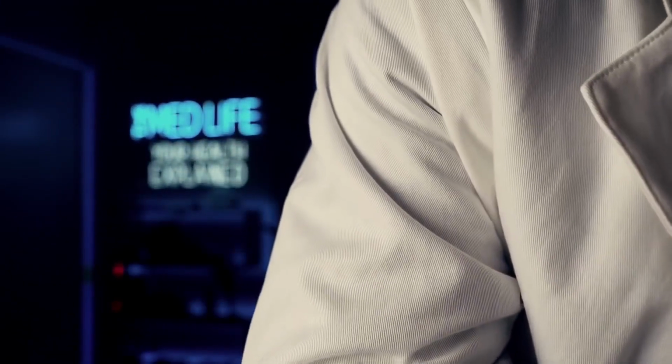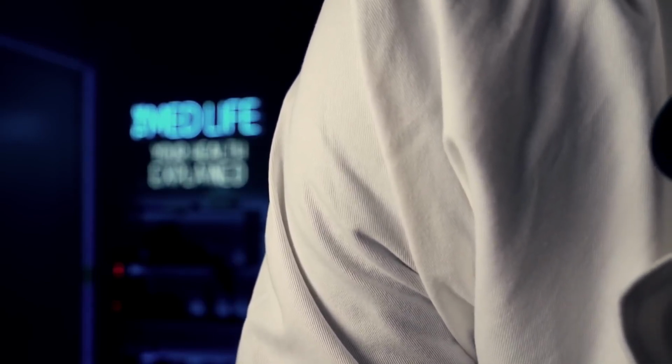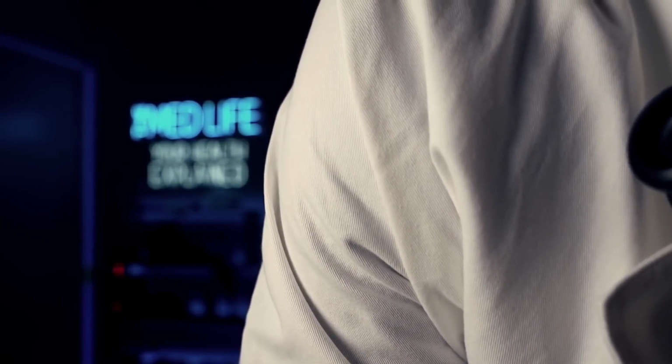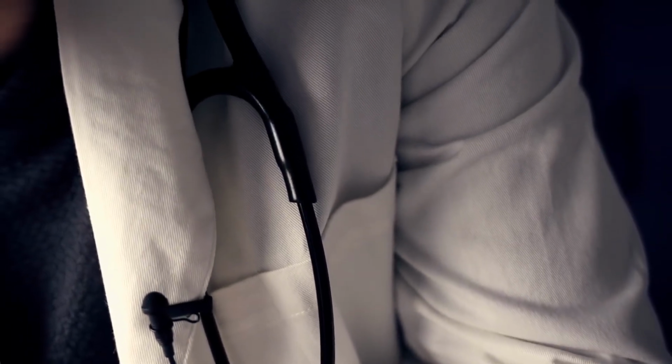Okay, I'm looking behind your ear first here. No signs of trauma or bruising. And you don't see any clear discharge, which would be concerning for CSF leak. Good. A little pressure looking inside the ear here. Good. Okay. Clear. No blood behind the tympanic membrane, which is a sign of trauma. We'll come to the other side. Okay. Now, also, back of the ear looks okay. A little bit of pressure. Good. That looks normal. Clear tympanic membrane as well. Very good. Okay. I'll change the tip here.